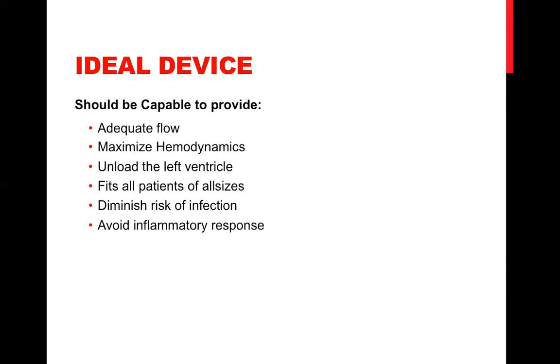There are many diversity and paradoxical studies about utilization of intra-aortic balloon pump in the cath lab. The main fear when an interventional cardiologist uses an intra-aortic balloon pump is when there is a bad target and terrible runoff. Of course, when you have a severe tight left main, every time you engage, you have a damping pressure. So you utilize the intra-aortic balloon pump during that time to increase coronary perfusion, because in these critical stenotic or subocclusive coronaries, you risk lack of perfusion for the coronaries and VFib. But it still remains paradoxical up to date.